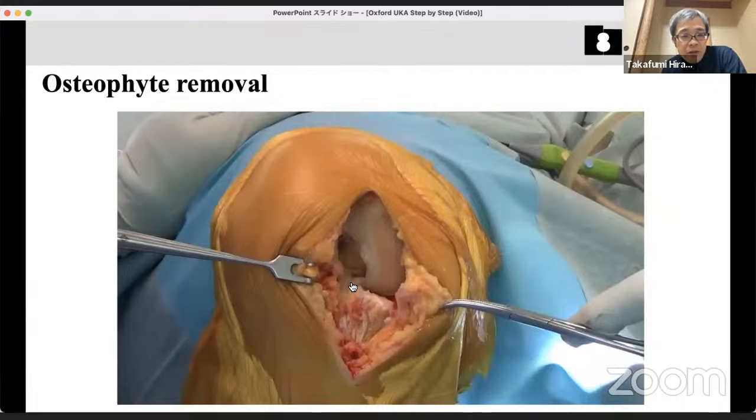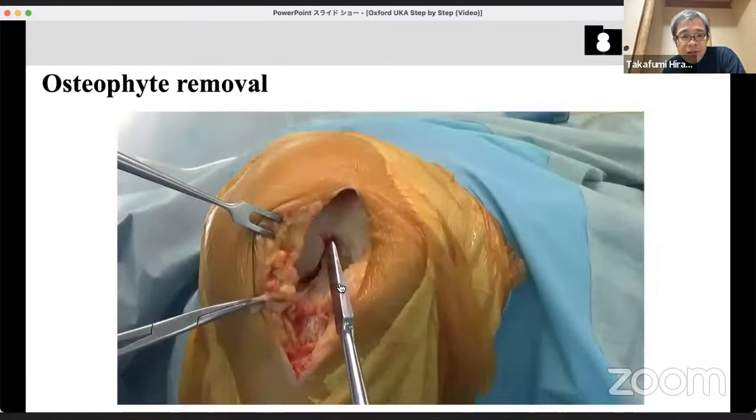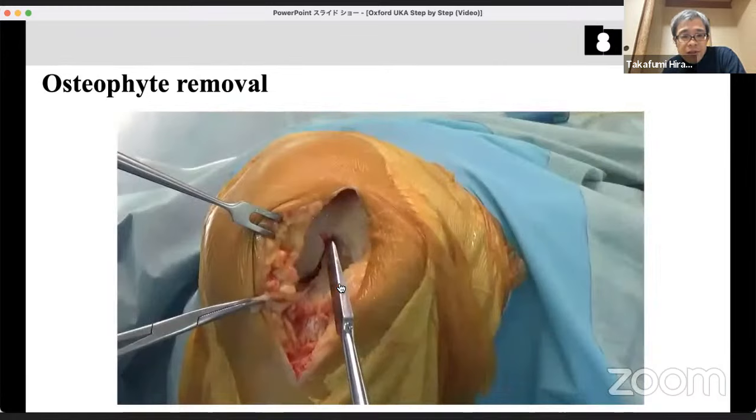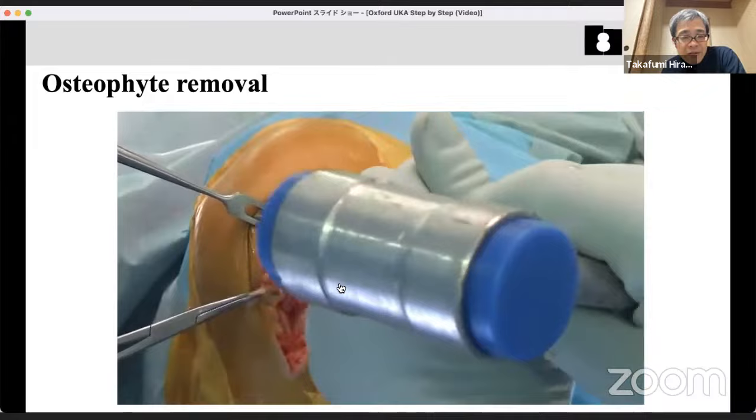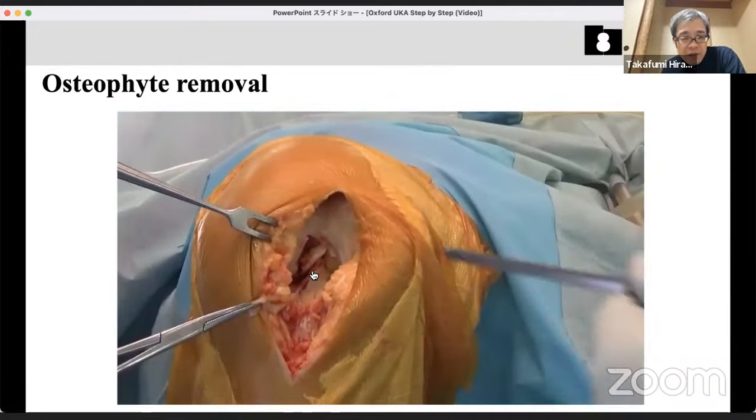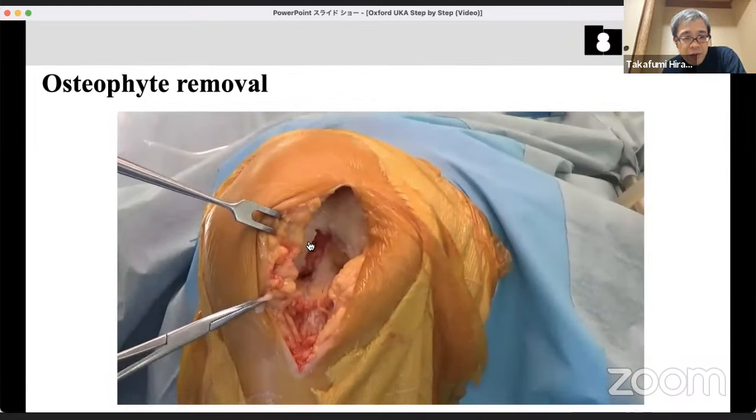The osteophyte may be covered by fat tissue or remnant meniscus, so touch this area with your finger first. Even small osteophytes must be removed completely. Next, remove the osteophyte on the lateral side of the intercondylar notch, as this can damage the ACL in the future. You should remove it to prevent subsequent ACL damage.